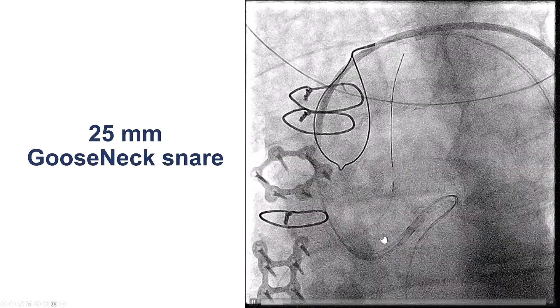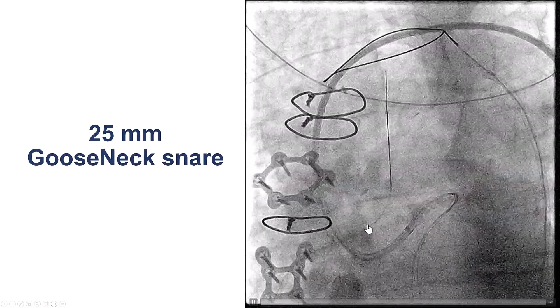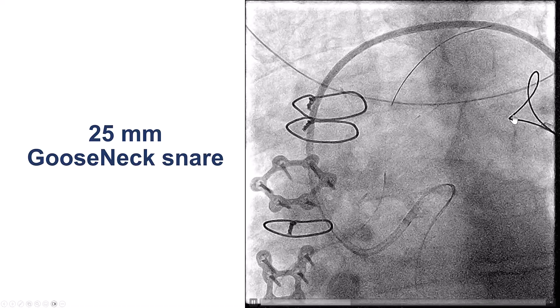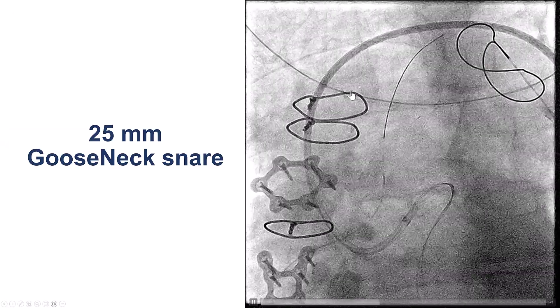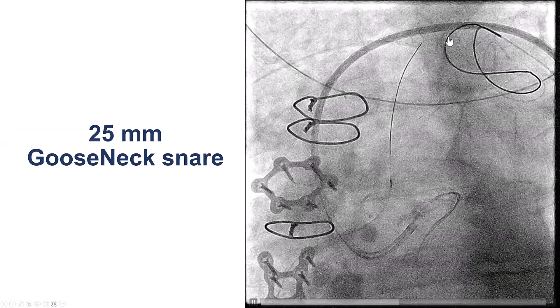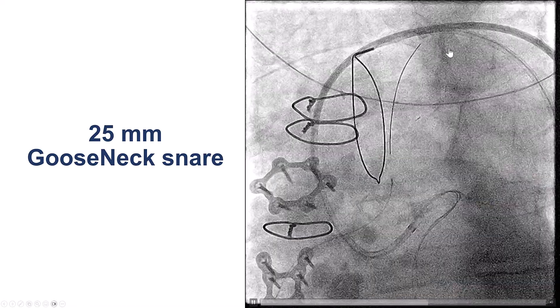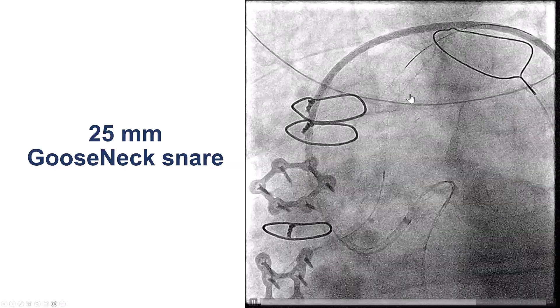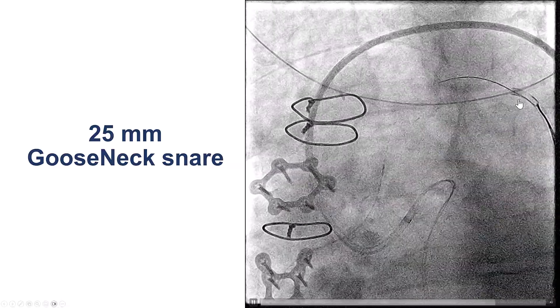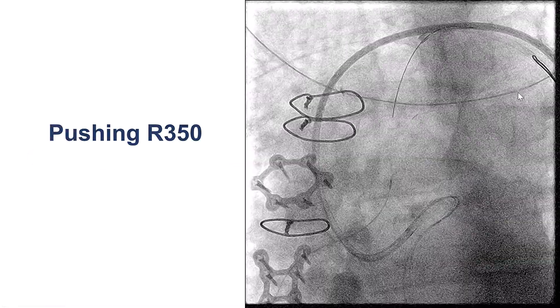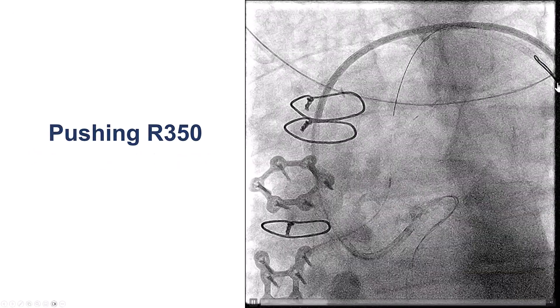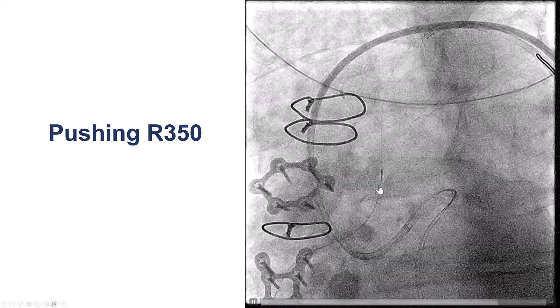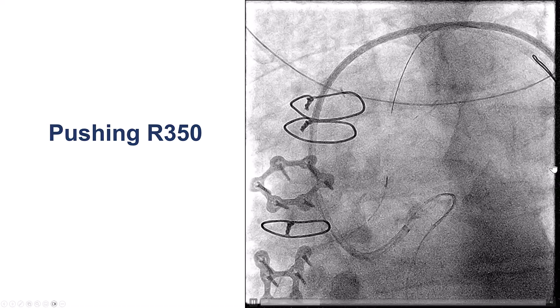The next step was straightforward. We advanced the microcatheter into the aorta and changed to an R350 guidewire. We didn't have a three-loop snare, which we usually use, so we used a gooseneck snare instead. There was movement of the snare and wire, trying to get them in the same plane to capture the tip of the guidewire. After multiple attempts, we barely caught it at the very tip, but unfortunately the wire came off the snare. However, it was already in the guide, so we were able to push the R350 and successfully externalize.